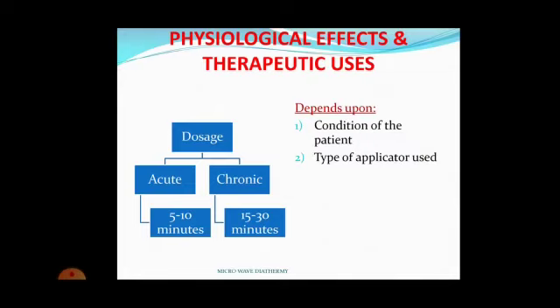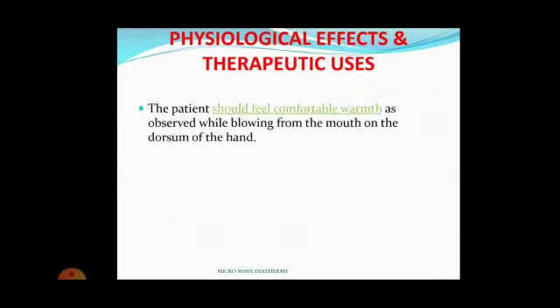Whether the patient is in good general condition to tolerate this microwave diathermy or not, and which type of applicator or emitter is used. Now, what should be the amount of heat that should be felt by the patient? It should be comfortable warmth.